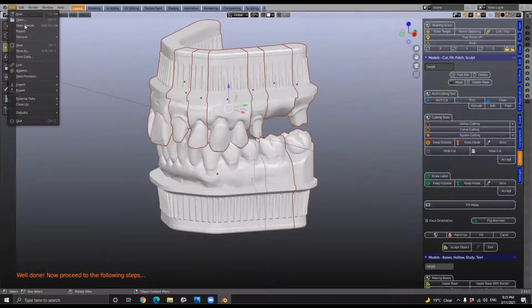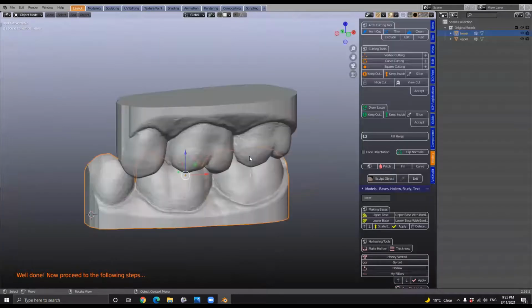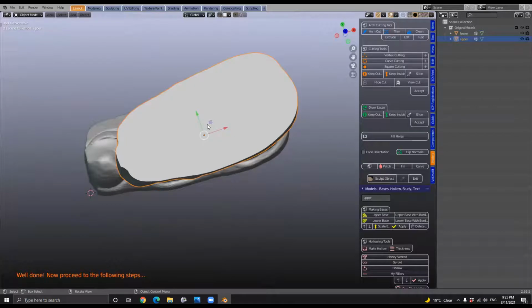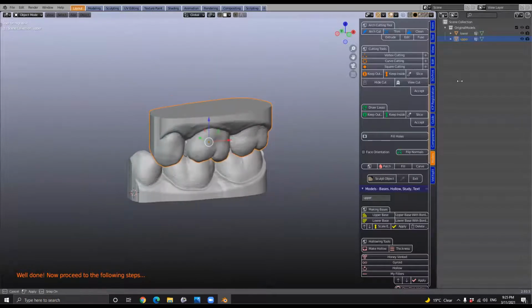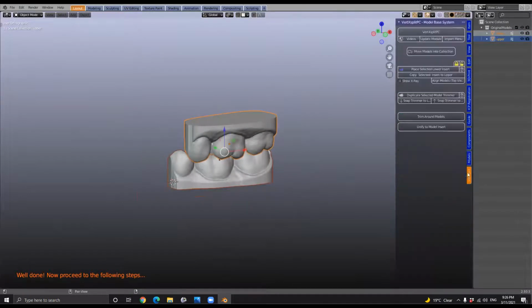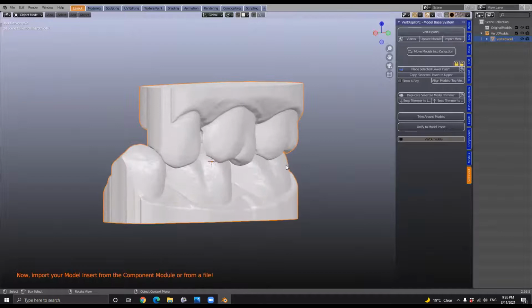Okay, so what I'll do is I'll open up another file, and we're just going to bring in this tiny little model. Now, if we would digitally create something like an inlay, we wouldn't bother making a model. But this is just a demonstration of how this would work on a miniature. So let's try that. We're going to do exactly the same thing. The first thing we're going to do is unite them. So we're moving them into the collection and they unite. If you only have one, you just do it with one model, and that's it.